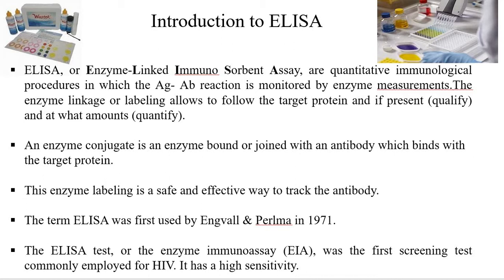In certain conditions, let's assume a person who has an infection. In the laboratory, in his serum specific antigens are present to rule out or rule in the presence of certain microorganisms. In other words, enzyme linked immunosorbent assay is an immunoassay technique involving the reaction of antigen and antibody in vitro. ELISA is a sensitive and specific assay for the detection and quantification of antibodies.